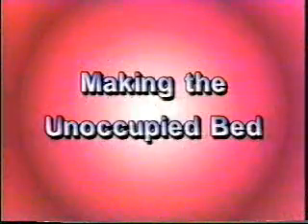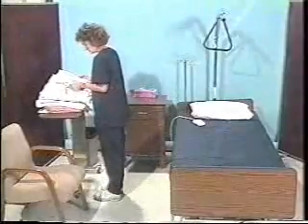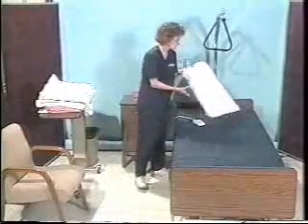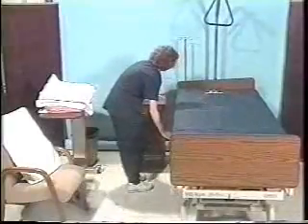Making an unoccupied bed. A patient has been discharged from the facility, and the caregiver is going to make a closed bed after the room and bed have been cleaned. First, the caregiver washes her hands and collects clean linen and places them on a clean surface. She adjusts the bed to a comfortable working height for using proper body mechanics.